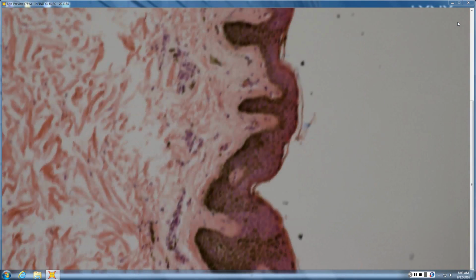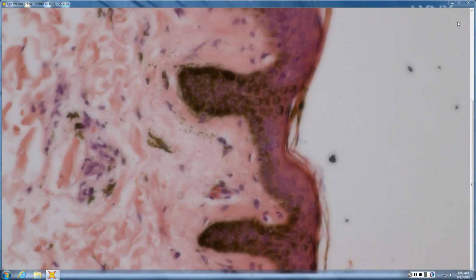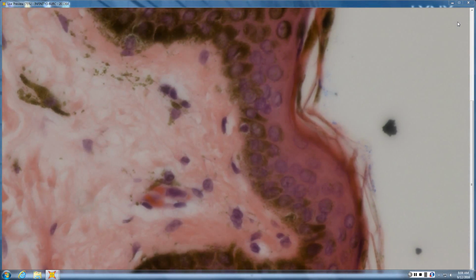So, right off the bat, there's definitely a lot of pigment along the DEJ. Are there melanocytes associated with it? There are always going to be some, right? Are they particularly increased in number? Do you see a melanocytic proliferation? I don't think so, but there are some bridging. Now, how about all of this pigment? Is that in melanocytes? Is it in keratinocytes? Any way to tell? I'd want to do a stain. Well, you can always do a stain if there's a question.